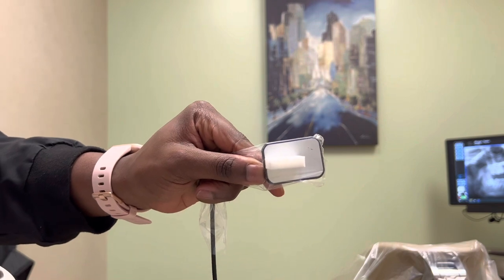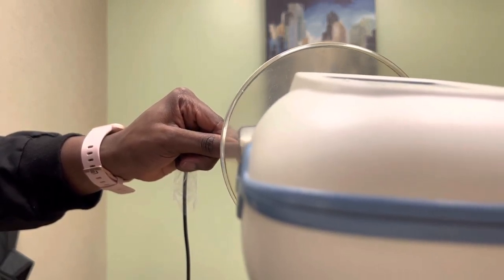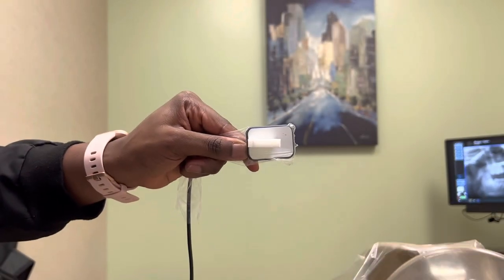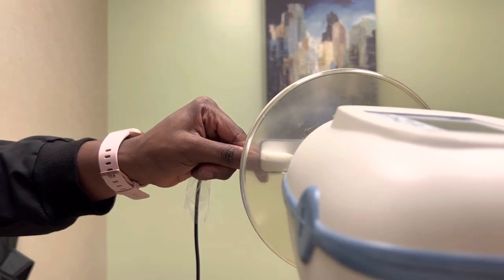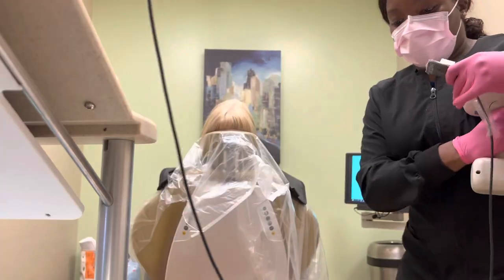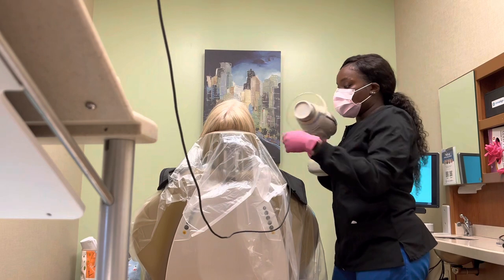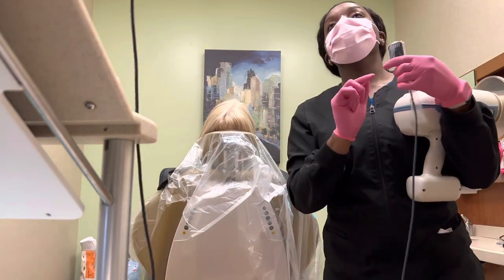When angling your x-ray tube, bring it over until the last thing you can see is nothing — if you still see tab, you don't have the full sensor covered. Bring that x-ray tube over until you can no longer see that tab, then stop — that's where you take your x-ray. Place the x-ray tube right where the edge of the circle covers the edge of the tab. Always have the patient smile really big. Your posture also has a lot to do with taking a good x-ray — don't be afraid to bring the chair all the way up to your height so you're comfortable and not bending your back. Have the patient smile really big and you should get the perfect x-ray almost every time.